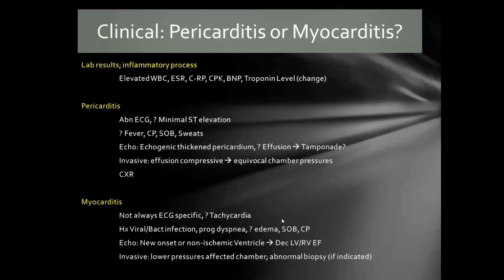And of course, we'll be asking and trying to find out a history of some type of infection and their symptoms. And then what we're really looking for in the echo, of course, is the ventricular function on either or both sides.